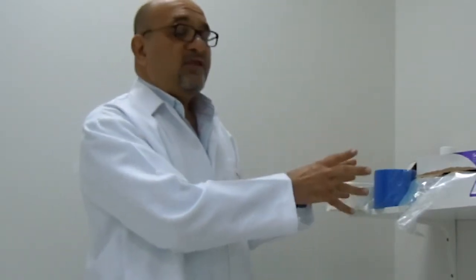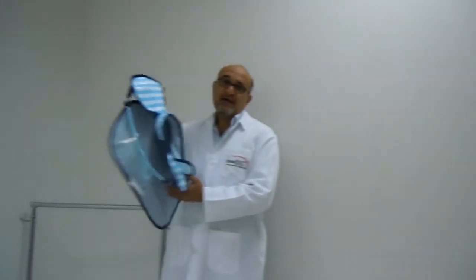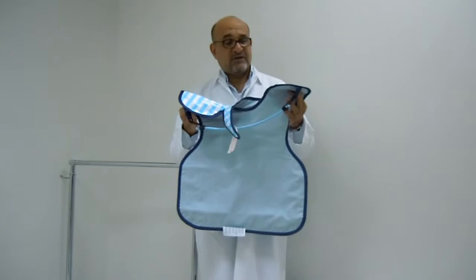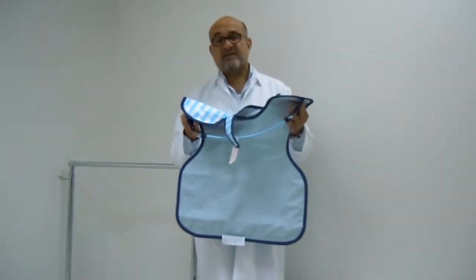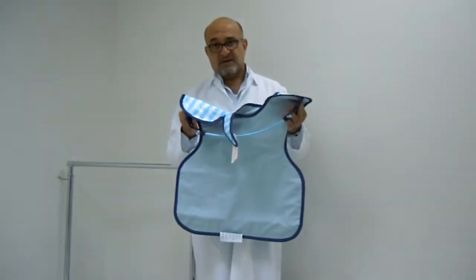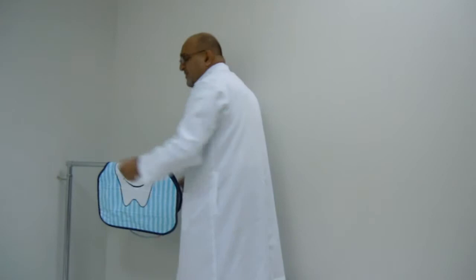With all these items present, you must also make sure that your lead apron is present and disinfected. Notice that I'm touching all these items without gloves because I'm assuming the person before me has already disinfected everything. So these surfaces are touched by ungloved hands only when they have been previously disinfected or covered with barriers.